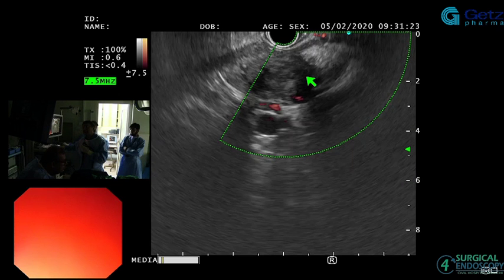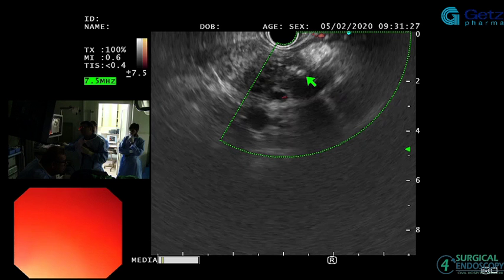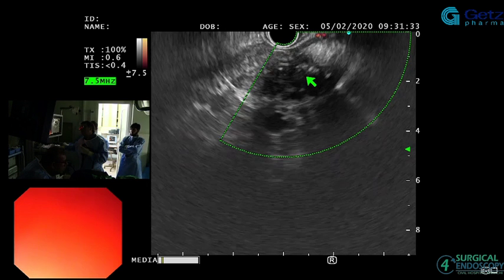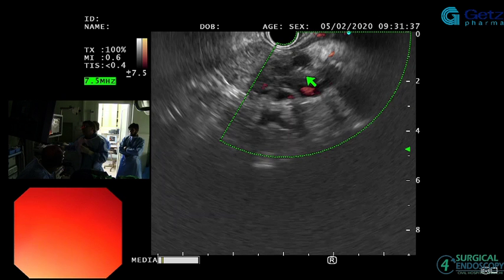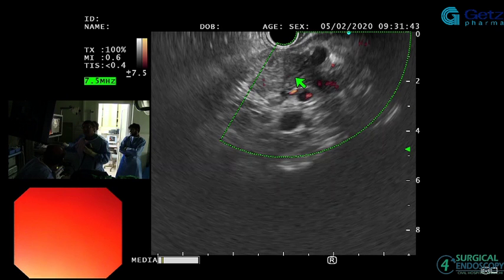What could be the reason for this? It's pancreatitis. Oh, okay. So I see Sadbhai. Yes, I am with you. Okay, so what I'm showing here right now, you see a nice pancreas right there, right? Okay, here, let me show you even a little bit better.